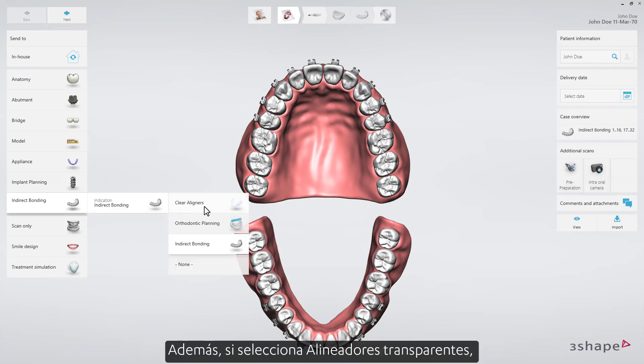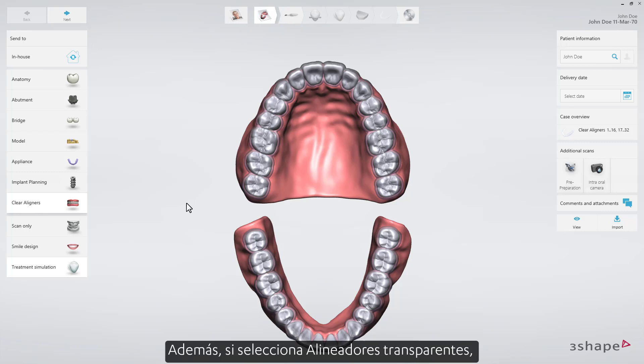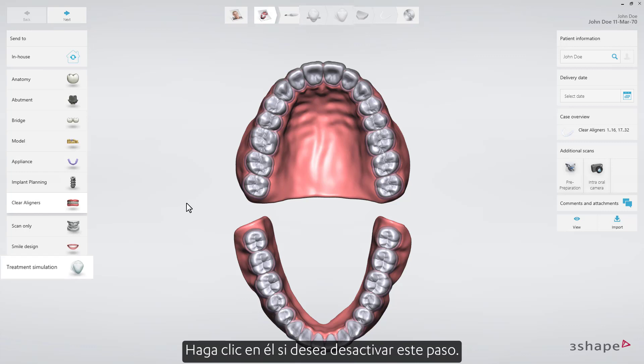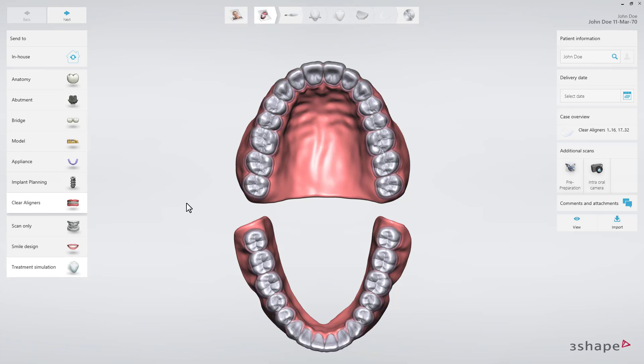Also, if you select Clear Aligners, the treatment simulation in the order form is selected by default too. Click it if you want to disable this step.